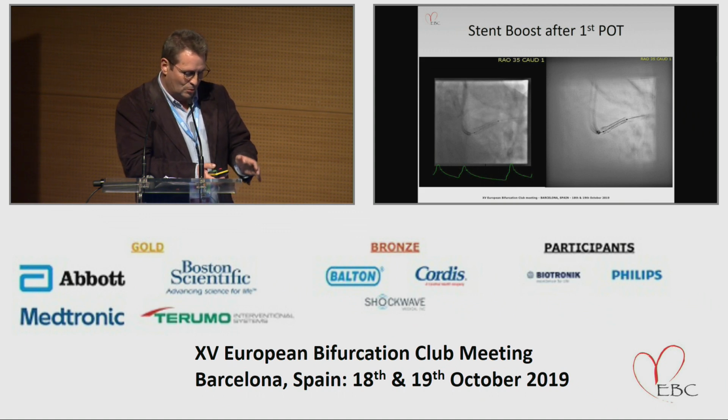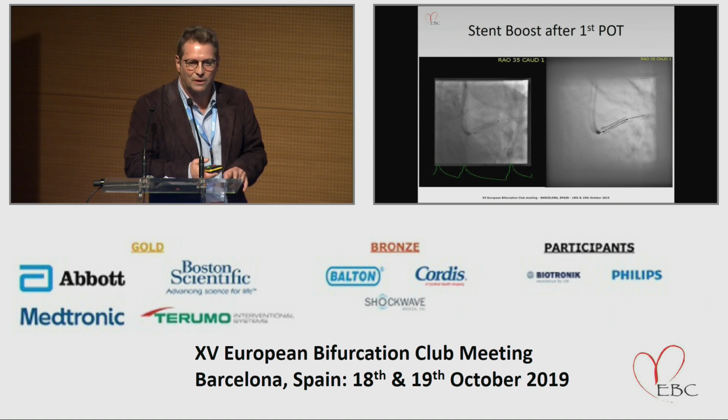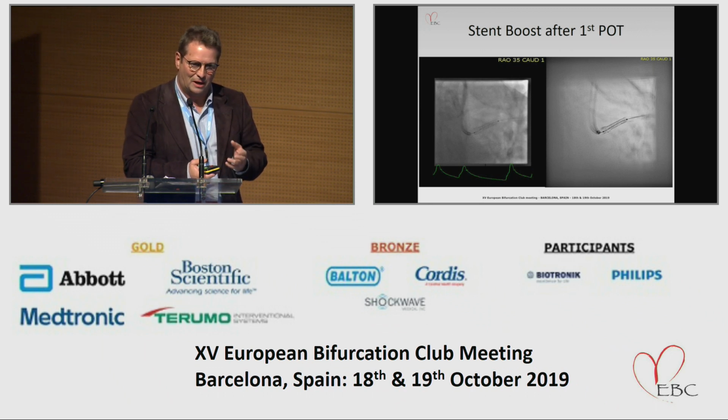You will maybe also appreciate, if you take a firm look at the right panel, that it's a very straight tube. The stent was implanted with 10 atmospheres, so it's supposed to be 3.5. At that stage, it was a 3.5 20 Megatron. So it fits the eye, and it fits what we were seeing in the angiogram. But we did an IVUS to see, because it was a bit puzzling that it was just a straight line.